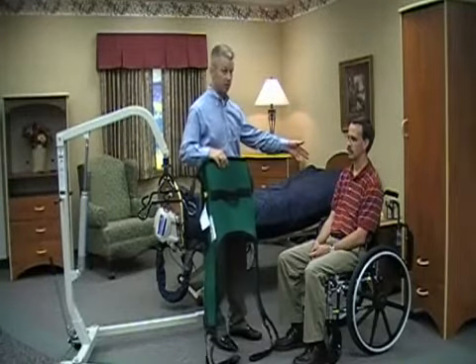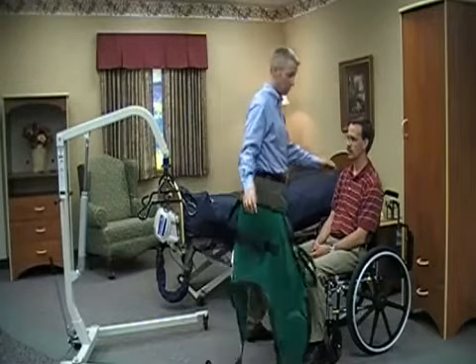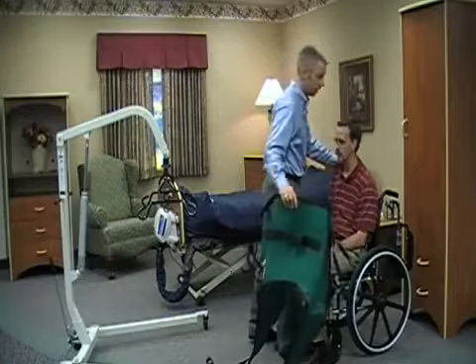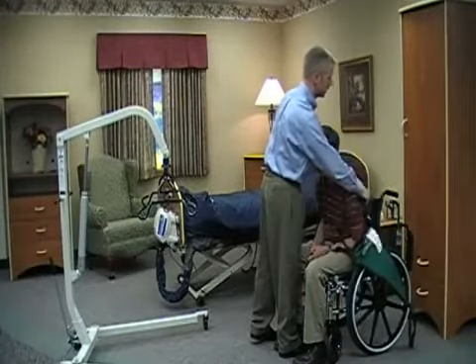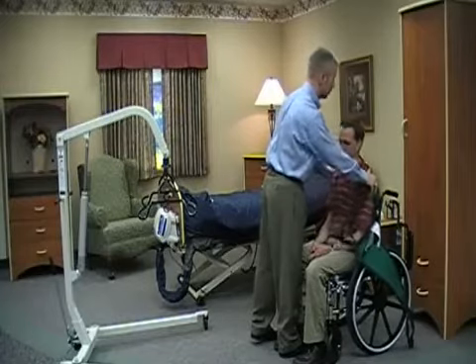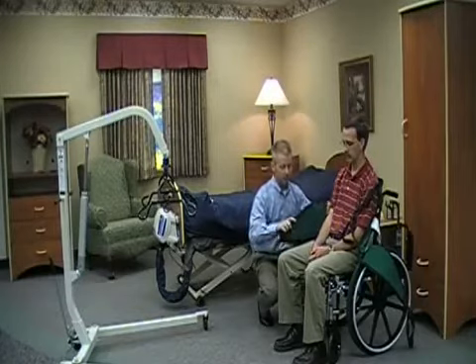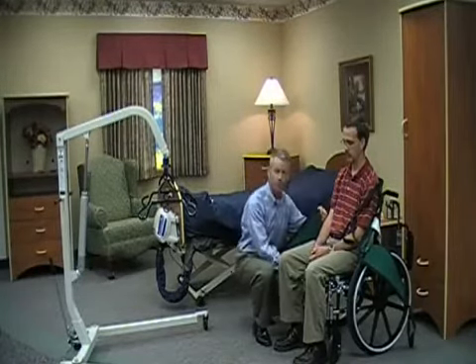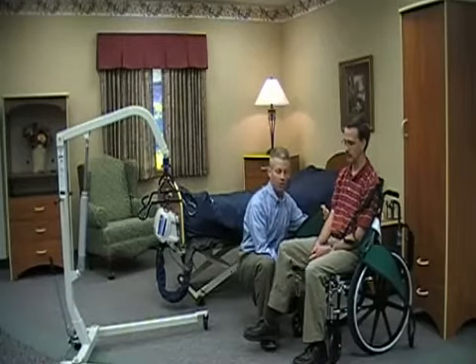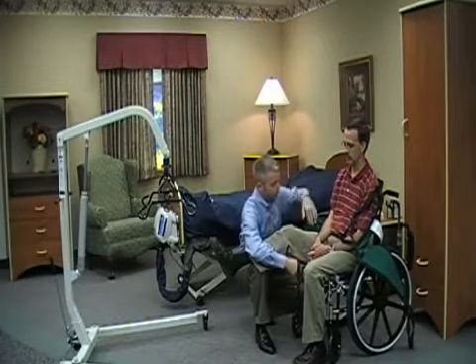I'll approach the resident and tell them the transfer I'm going to do and what the process is going to be. I will put my right foot or left foot between theirs and lean them forward to me. From there, I'm going to fit that sling behind the resident, tucking it down until it's in a comfortable position, and then pushing them back on top of it. Then I'm going to draw each one of the leg straps down the side, and once I have it down to the resident's side, I'll either prop their foot on top of my foot, or if they can elevate it, lift their leg on top of my leg so that I can slide that leg of the sling underneath appropriately.